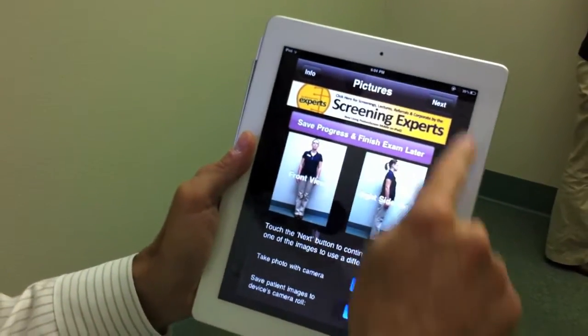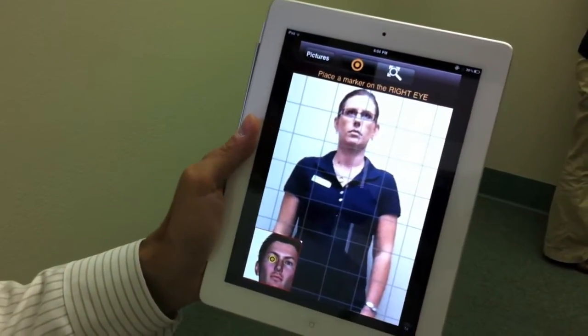So that's how you do the calibration. The next step is easy — you do your postural assessment. Thank you.